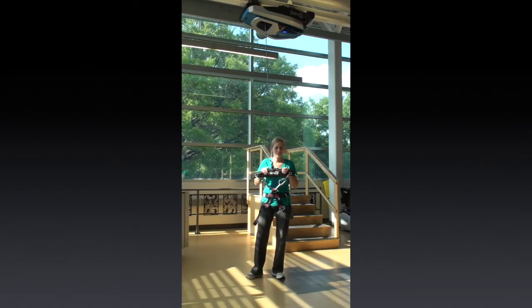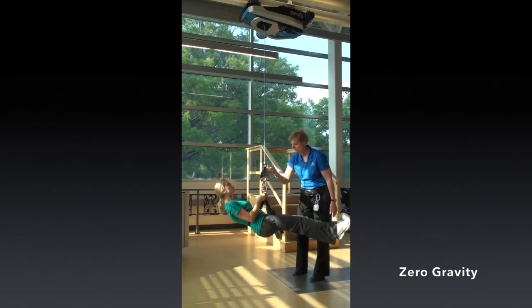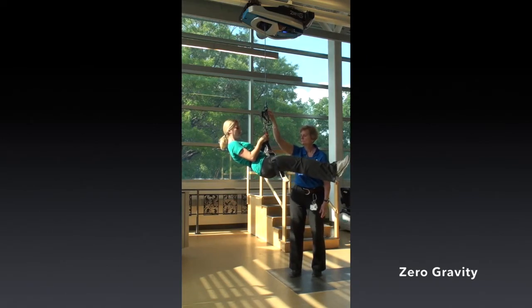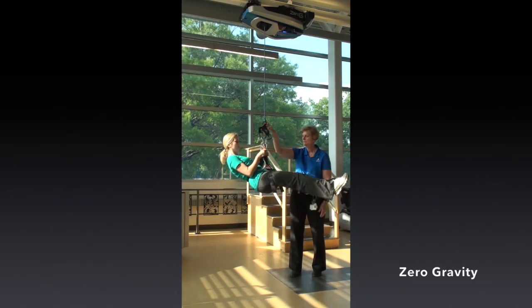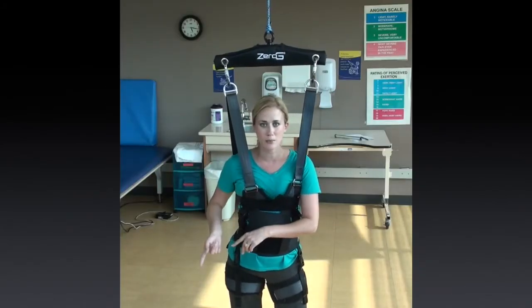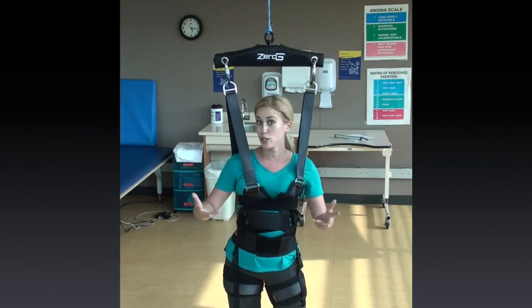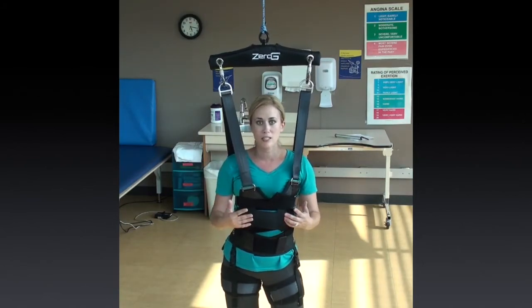Now we're going to show you what it's like to be in zero gravity in Zero-G. I did jogging up to 5 miles an hour, I did squats, I did jumps, I did hopping, push-ups. I did a lot of activities, and that's really what you're going to do with Zero-G — those types of activities that you would normally do with your patients. It's just giving you a safe environment to do functional and intense activities.